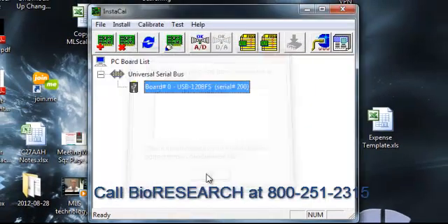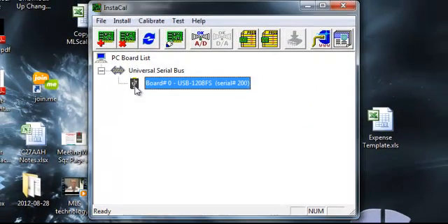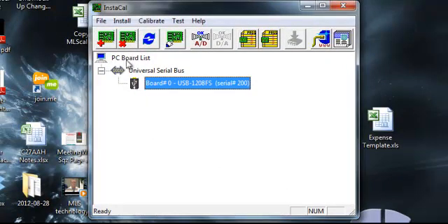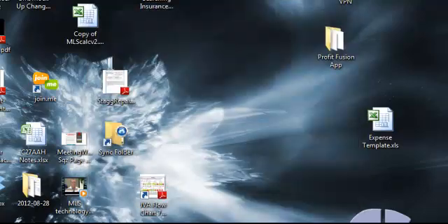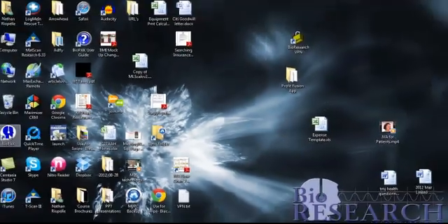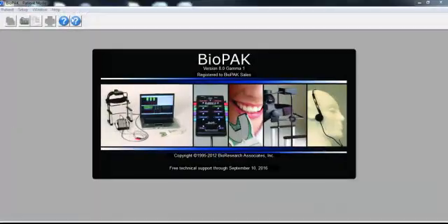So what I'm going to do then is click OK. And then what you'll do is you'll notice that this USB icon is right here, so that means it recognizes the device. Just go ahead and close this, and then we're ready to reopen the BioPak program and go into Record Mode.